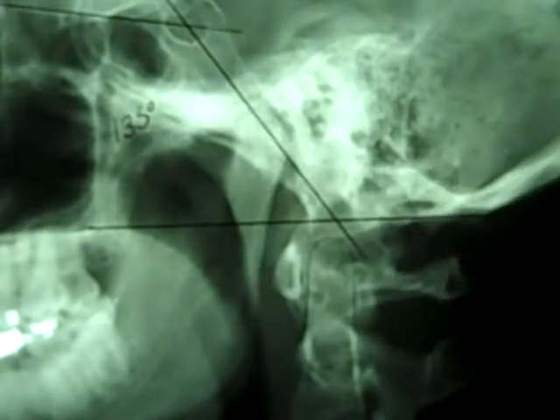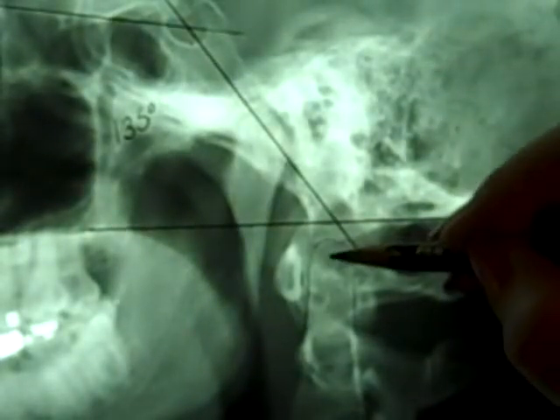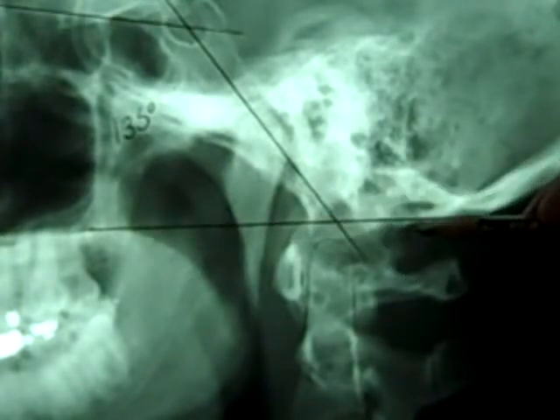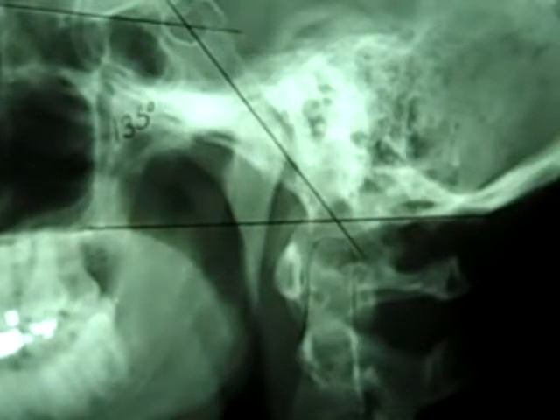So you see that on this particular film it's not any above the line. On paper I would record this as 0 and move on. But what I don't want to see is this above this line, more than 8 for males or more than 10 for females. If it is greater than either of those numbers, you would need to be worried about platybasia and or basilar impression.